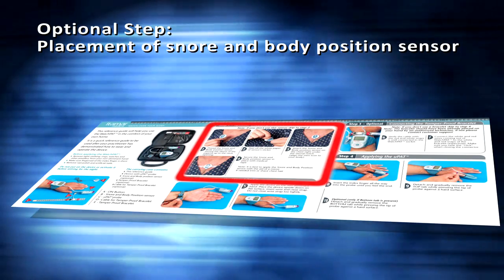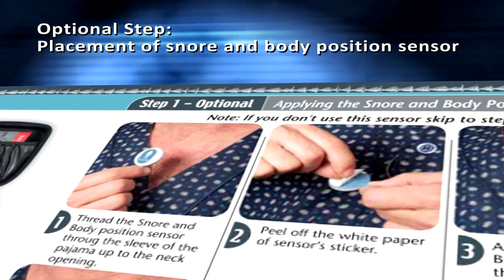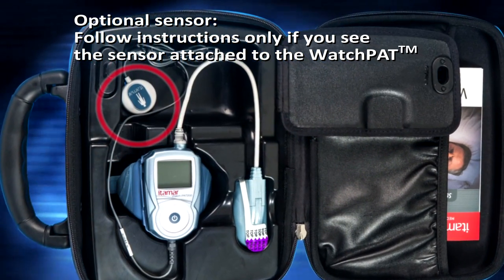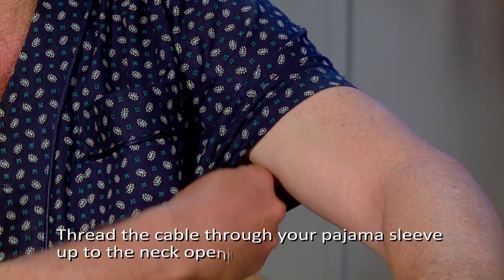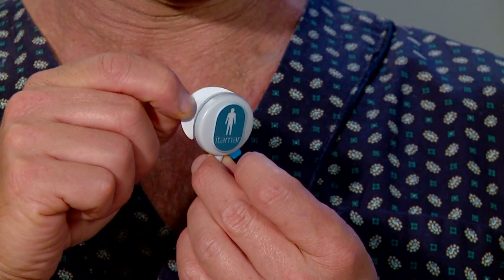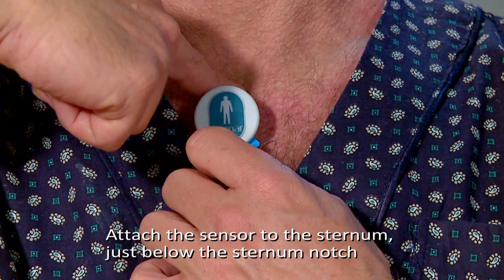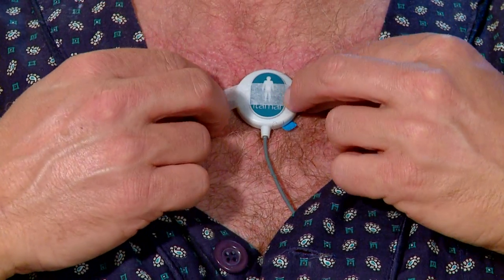Optional step: placement of snore and body position sensor. Follow instructions only if you see the sensor attached to the WatchPat. Thread the cable through your pajama sleeve up to the neck opening. Peel the backing from the small round sticker of the sensor, and attach the sensor to the sternum just below the sternal notch. Trim or shave chest hair if needed, and secure the sensor in place with medical tape.